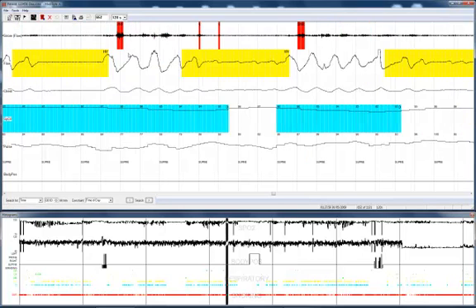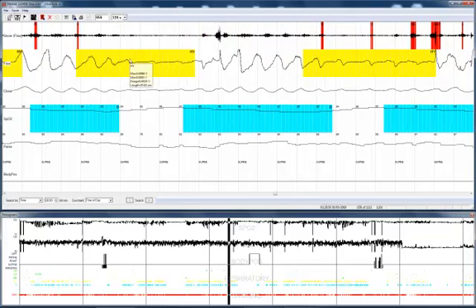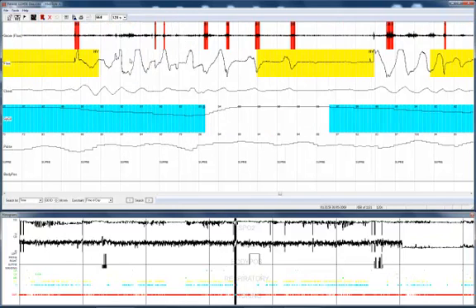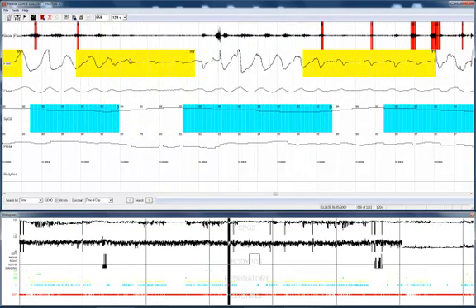To navigate around the display screen, you may use the arrow keys on your keyboard. An arrow pressed to the right moves you ahead in time. An arrow key to the left moves you back in time. You may also use the page up and page down keys.